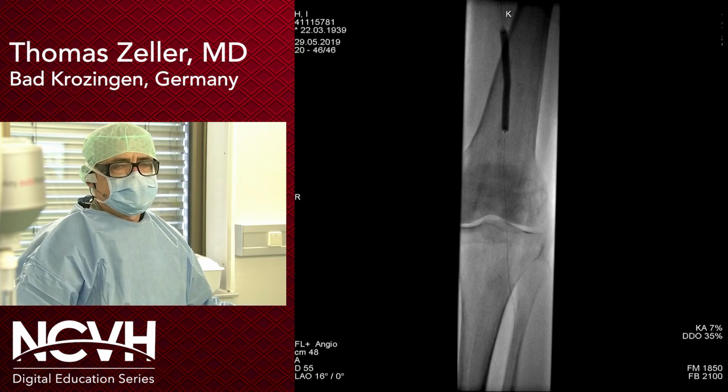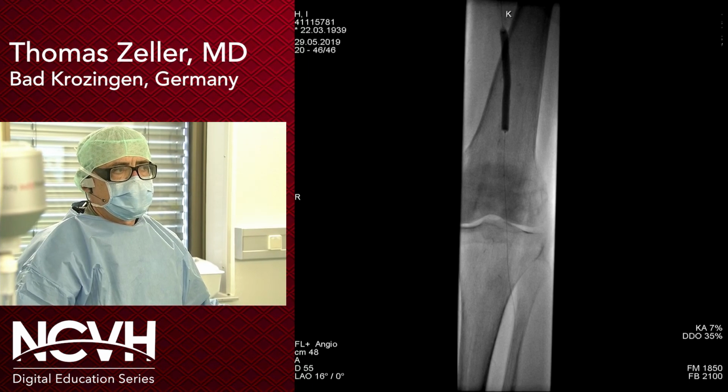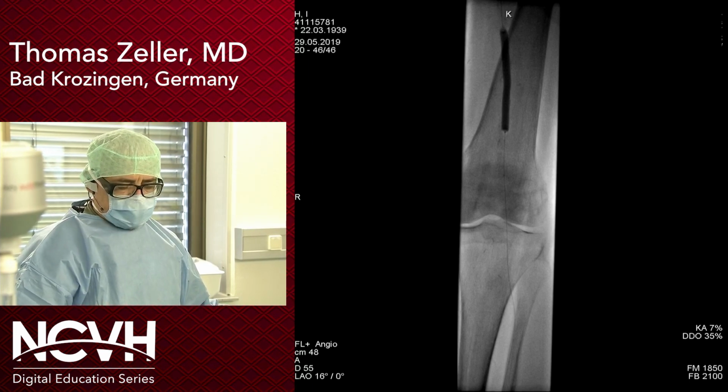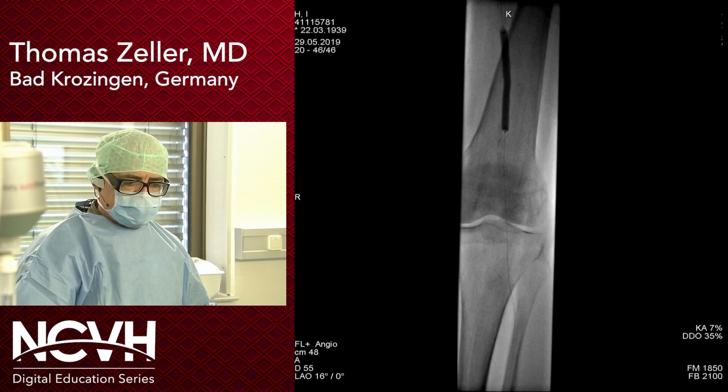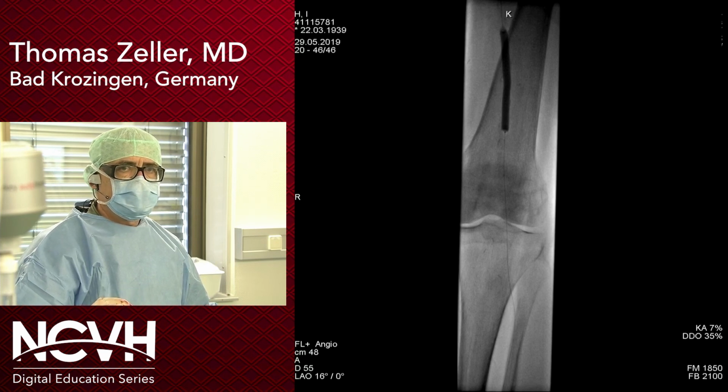It does mean that there is no dose correlation between paclitaxel exposure and mortality. And therefore, I'm not so hesitant to use overall here 3 drug-coated balloons, in particular considering that the 3rd balloon is a very small balloon, 2.5 millimeter dimension only, so the overall drug dose is relatively low, even if it's a 30 centimeter long balloon.